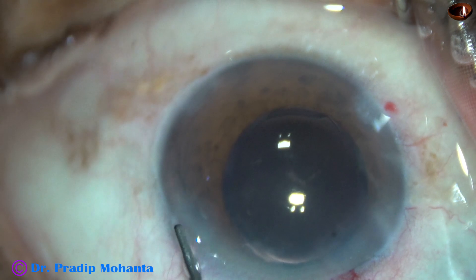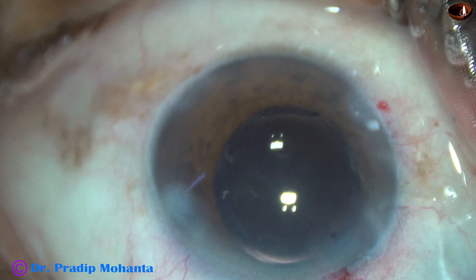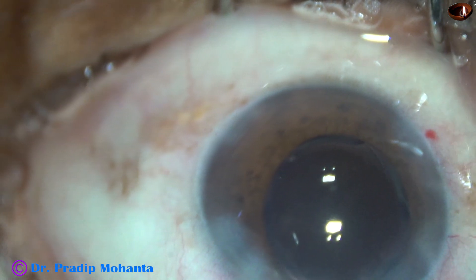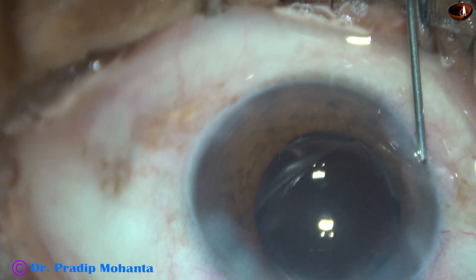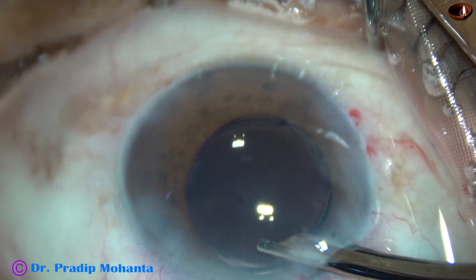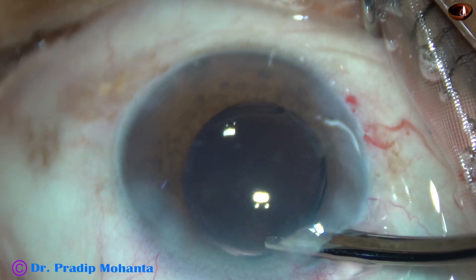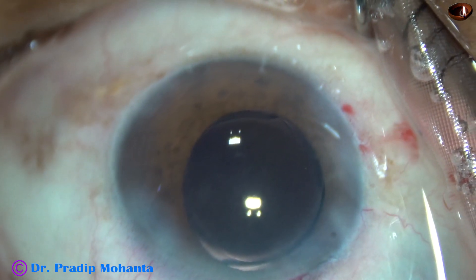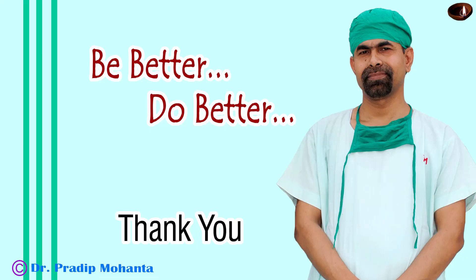And now the side ports are closed by hydrating the corneal stroma. This patient didn't reveal history of trauma — it was discovered on the operation table. The anterior chamber is nicely formed and the case is concluded. Thank you very much for your attention. Hope this video will help you in managing such cases in your practice.